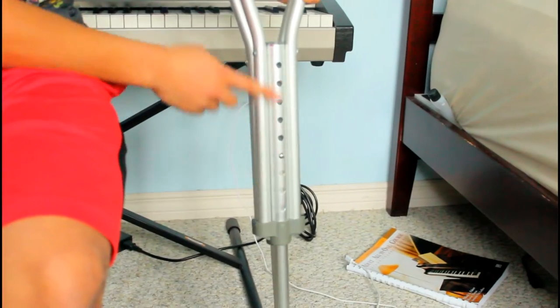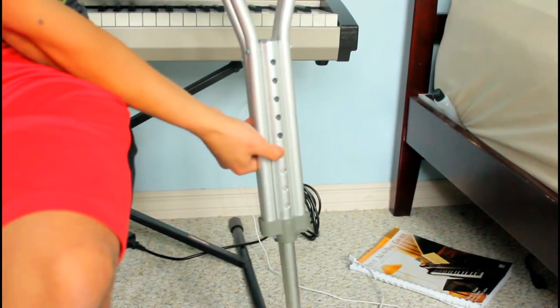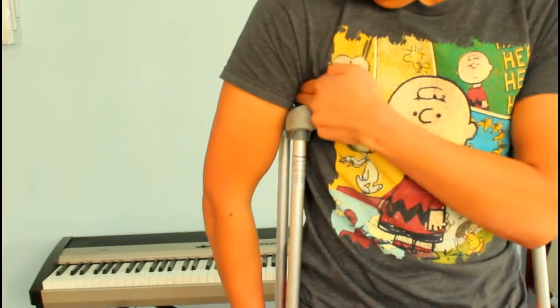First off, when you get your crutches, you're going to want to look to the side and see a height adjustment scale, which you're going to want to properly adjust to your correct height. And then you put them on the ground, get some good balance, and make sure your armpit and the crutches have at least an inch and a half of space between them, which means about two fingers.